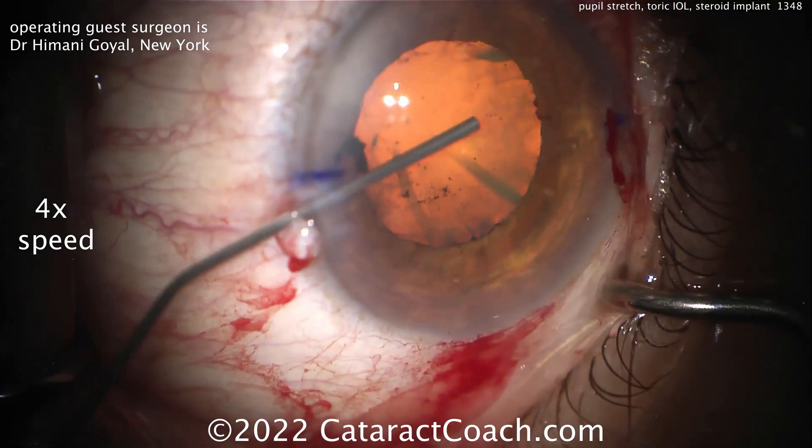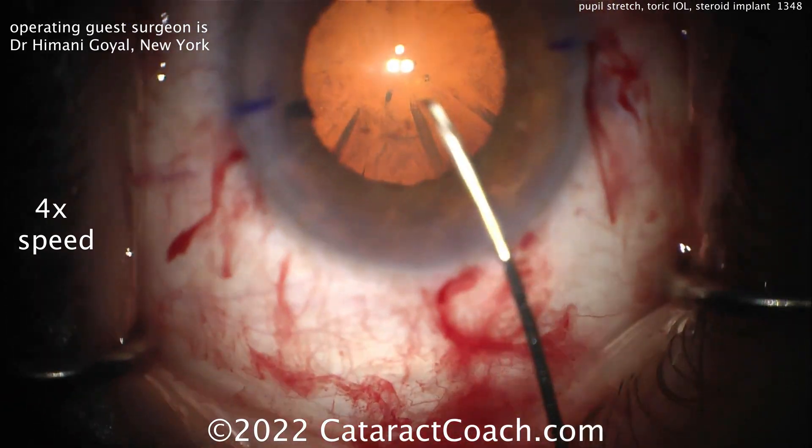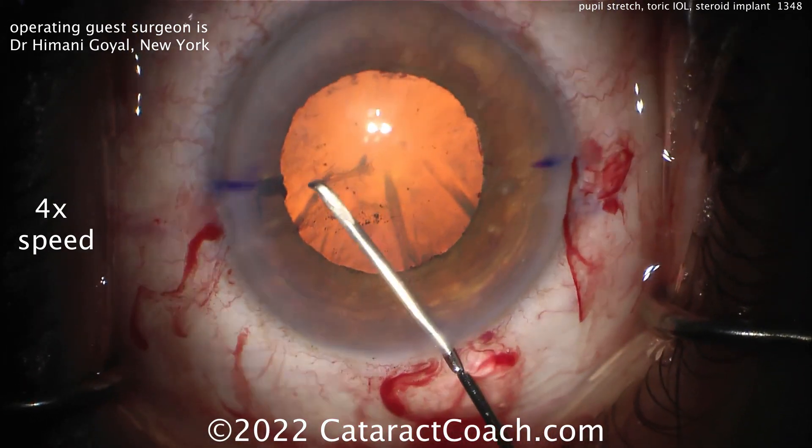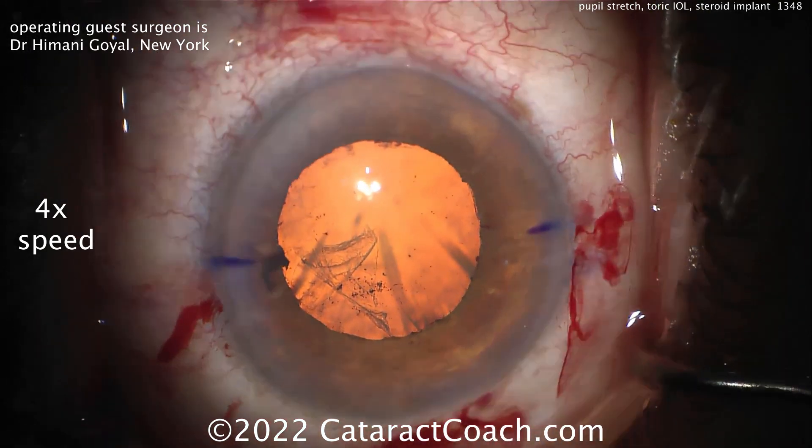Here now, a little more viscoelastic always helps. And then time for the rhexis. Cystatome going inside and getting that flap turned over — a nice, good-sized capsulorhexis.